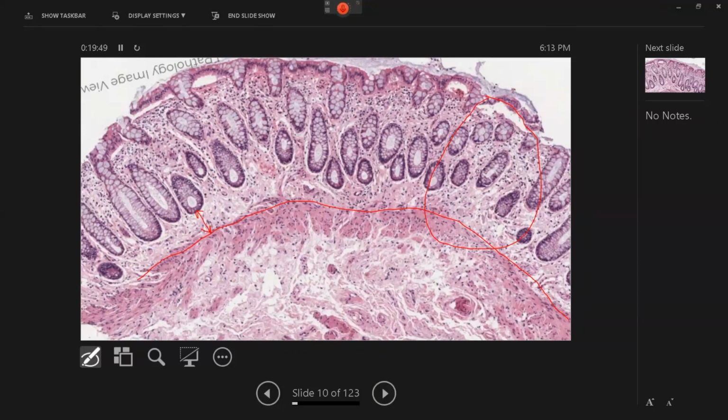This was a follow-up biopsy, the patient is on maintenance treatment and has been in remission for a year or 2 or 3, so they just do follow-up biopsies, and sometimes this is what you will get. So this here is quite important in that context, and it tells us a lot of the story about what is happening.